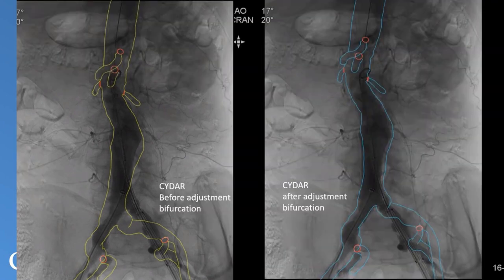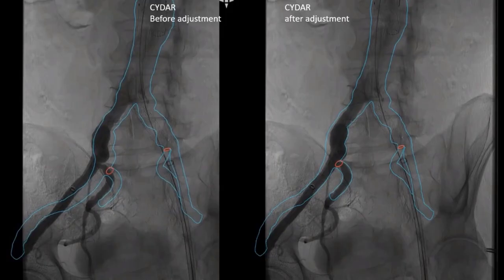Here are a few examples of the selective adjustment. On the left side of the screen, the aortic bifurcation before adjustment, and on the right side after adjustment. Another example shows adjustment at the iliac bifurcation: left side of the screen before adjustment, right side after adjustment.